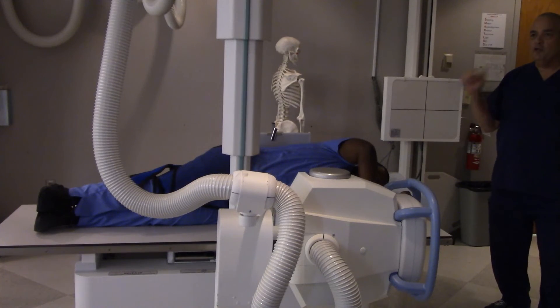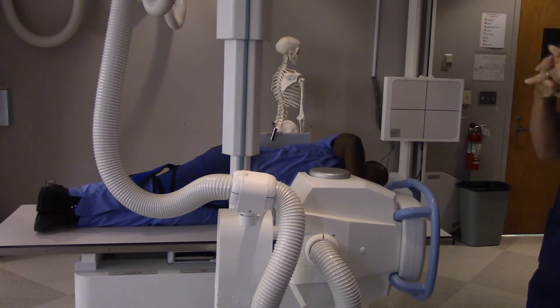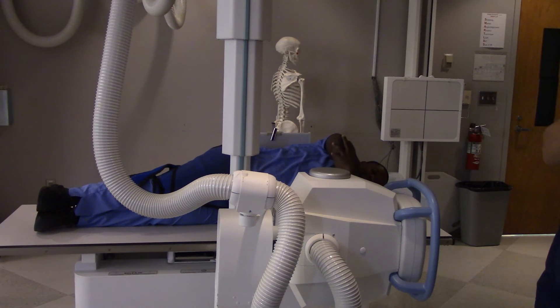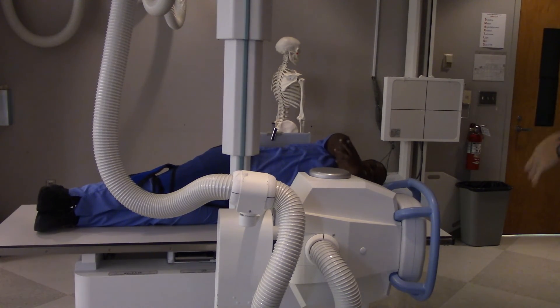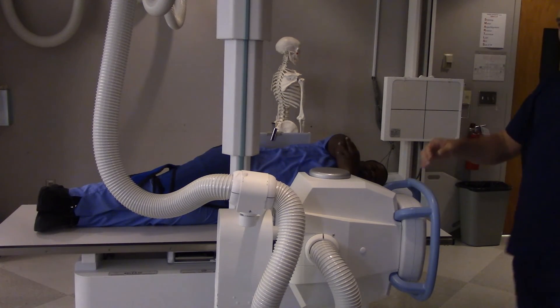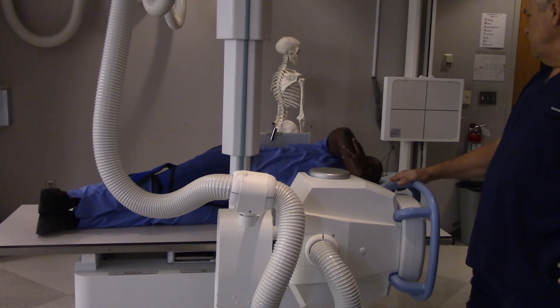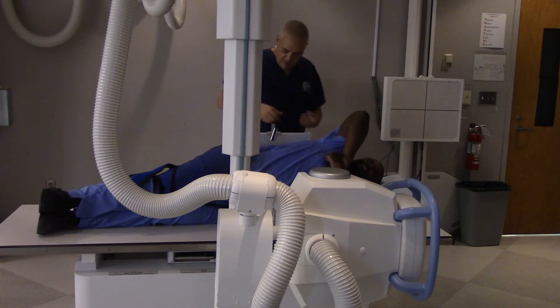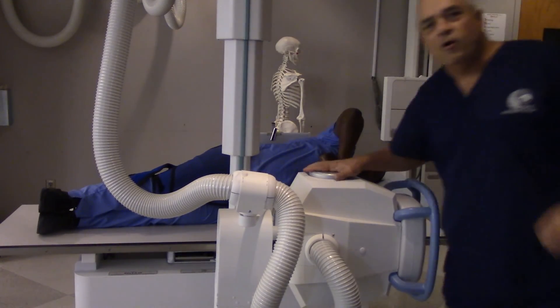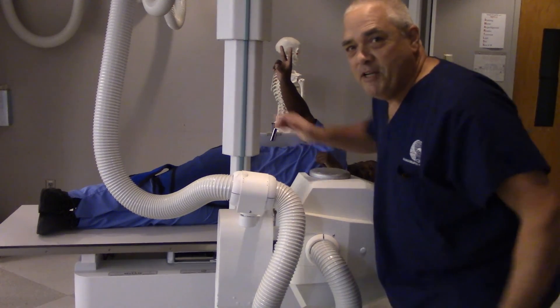So now I have done a decubitus abdomen x-ray. Did I miss anything? This is y'all's opportunity to critique the prof. Tell me about all my misdeeds. Do y'all feel like you can replicate all this? You got this? All right, we'll see. Thank you all so much for tuning in. This has been another exciting episode of X-ray Education, featuring X-ray Ed and company. See y'all next time.